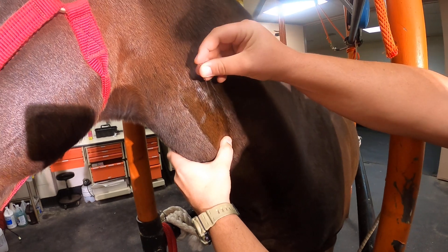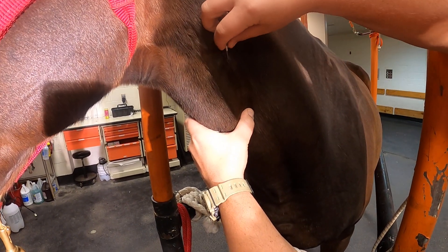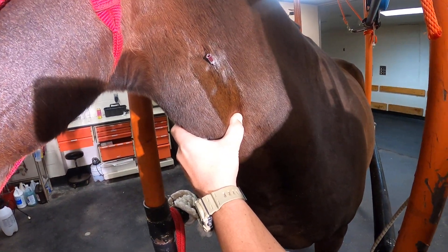a one and a half inch needle is placed downward at the center of the distension of the jugular vein. Once it's placed in, it's pushed all the way to the hub.